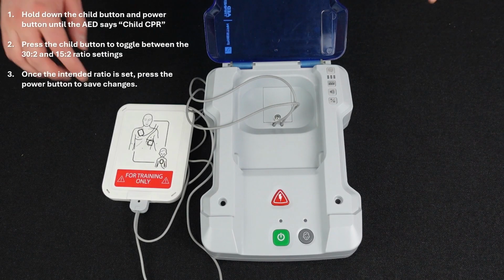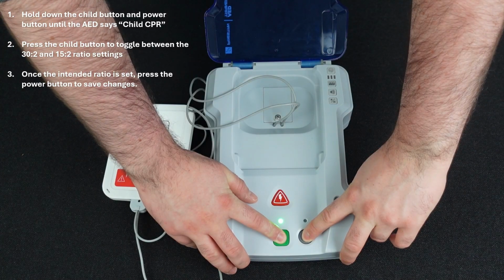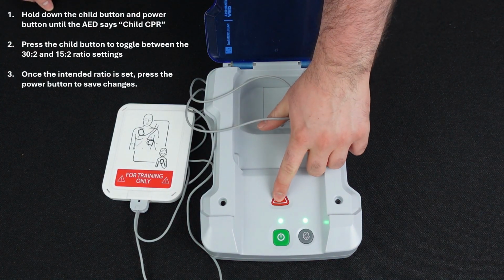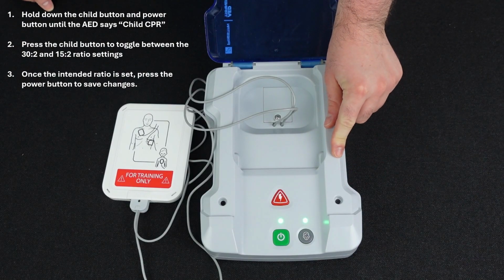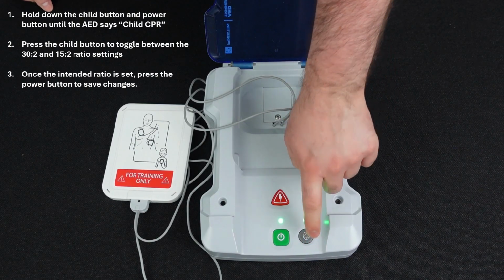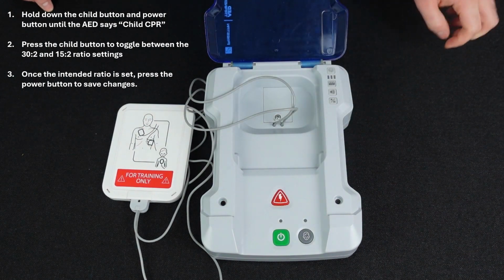If you are going to work on a child mannequin and would like to change the compression ratio settings, then hold down the child button and power button together until the AED says Child CPR 15:2 or 30:2. You can then press the child button to toggle between the 15:2 or 30:2 ratio settings for the child CPR scenarios. Once you've selected the one you would like, click the power button to save changes.